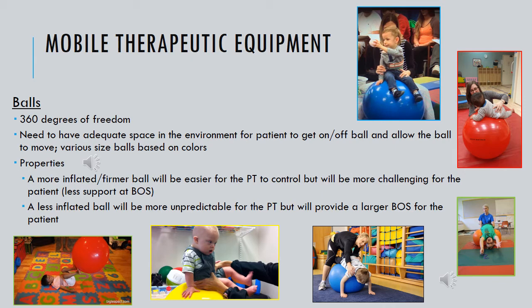If the ball is underinflated or less inflated, it's a bit more challenging for the physical therapist to control because the movement's unpredictable. But it might be easier for the patient as they might sink down a bit more into that surface and therefore have a larger base of support.